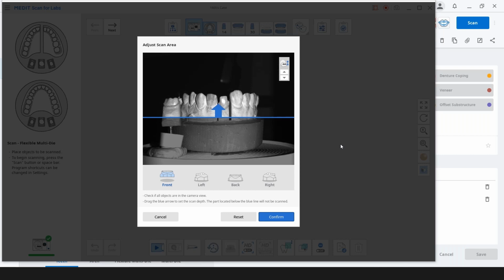Absolutely. So this is in regards to, I believe, making the adjustments, the brightness of the color and so forth, like you were showing us. The question is, if I make it bright, is it well scanned? So why do you need to adjust the brightness? Is it something that will affect the scan later, or is it just so you can view it better with the cameras?